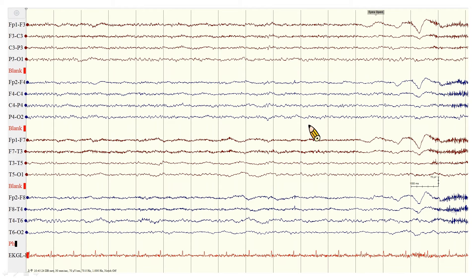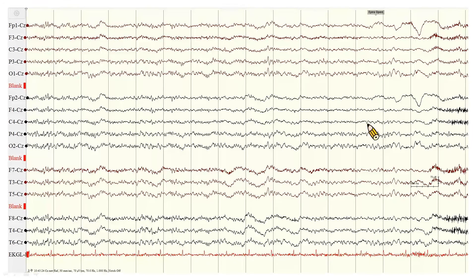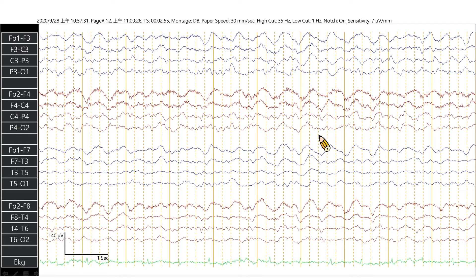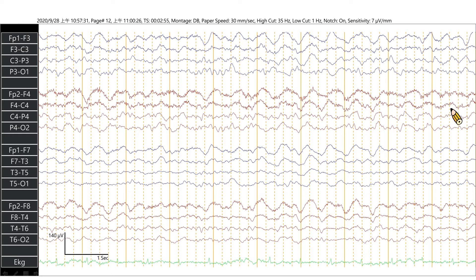Remember to use at least two montages — better with one reference montage and one bipolar montage to read EEG. After changing to CZ montage, GRDA appears again. In another patient's EEG, we can see rhythmic delta activities over the bilateral frontal region — this is FIRDA, or frontally predominant GRDA. In that patient, this was a case of hydrocephalus.